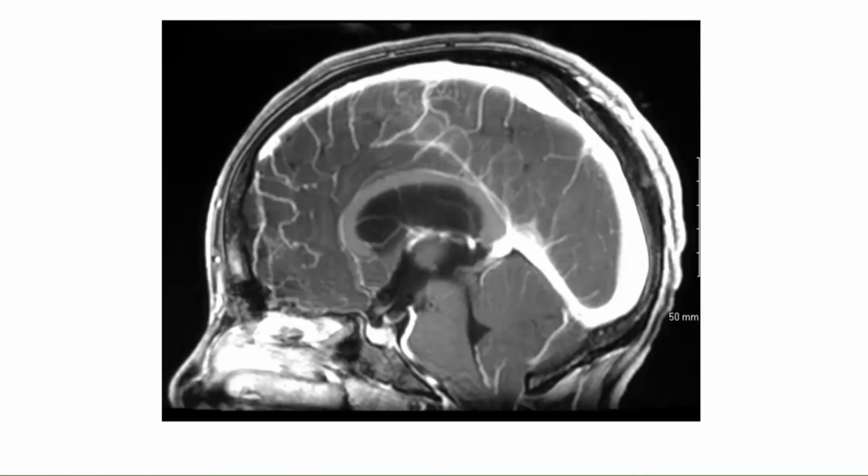The reason why that initial image from childhood is important is that for most of our children, or for that matter adults, tonsillar ectopia doesn't just suddenly start one fine morning. Usually, if you serially scan them, we usually don't, but if you have more than one scan, the tonsillar ectopia is usually present. So the fact that it was absent when she was young and suddenly came around at 12 years of age when she's sitting in your clinic leans you towards thinking that primary tonsillar ectopia was never the problem, and maybe it's a secondary issue.